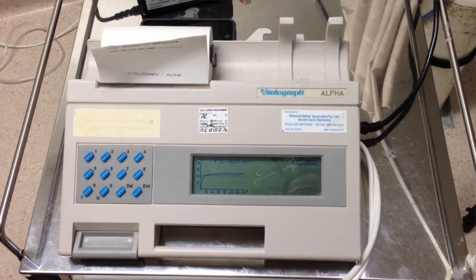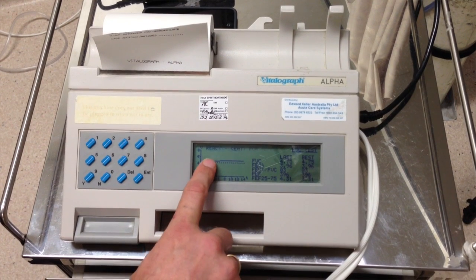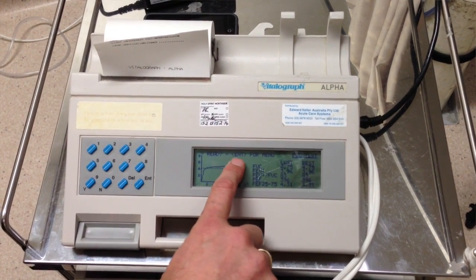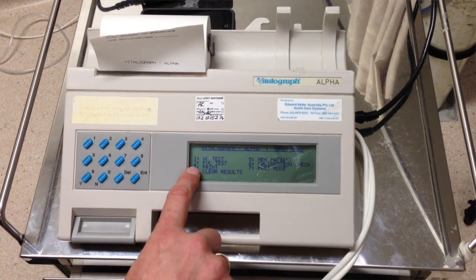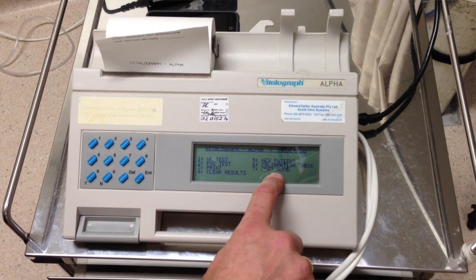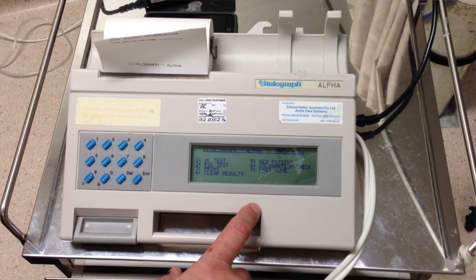Press wait and let it go through its tests. It will give you the last displayed numbers and then ask if you want to do another test. It's popping up and it says ready — so I can do another test immediately or press enter for menu. If I press enter for menu, I can print it out, or if I need to give Derek a nebulizer, I can do that. Keep the machine plugged in and turned on because if you turn this machine off, it will wipe everything you've done.